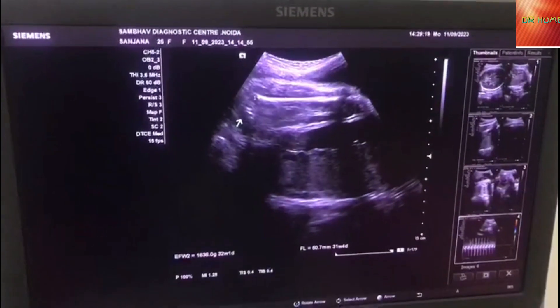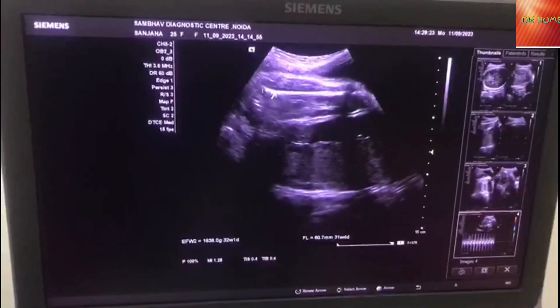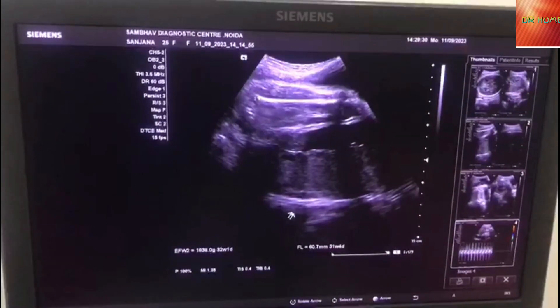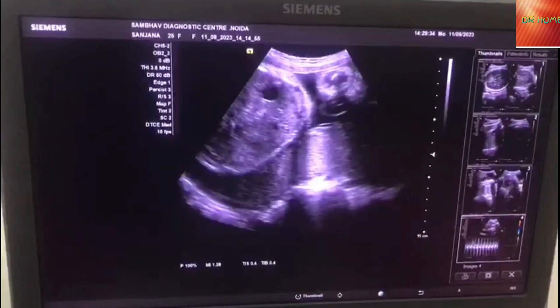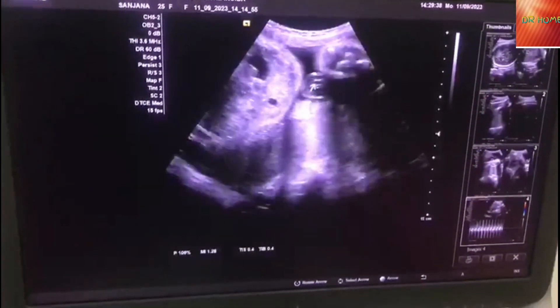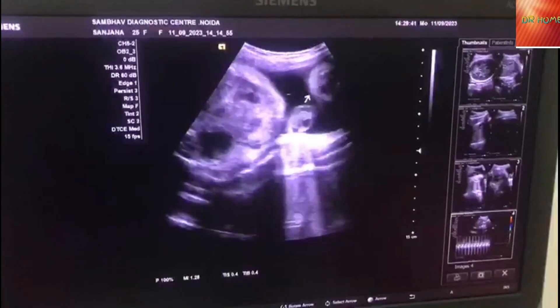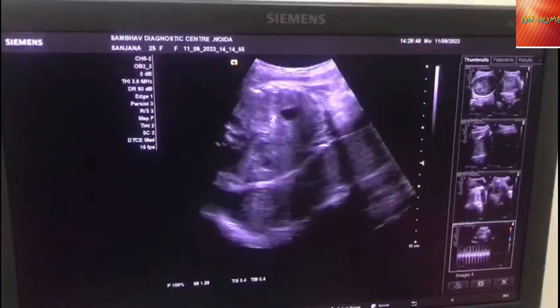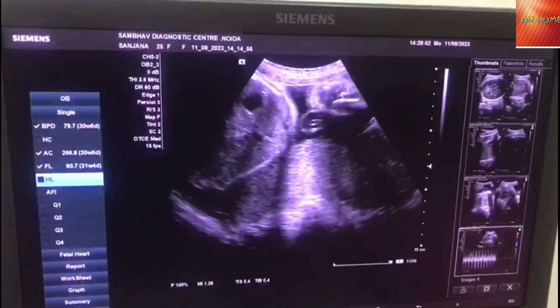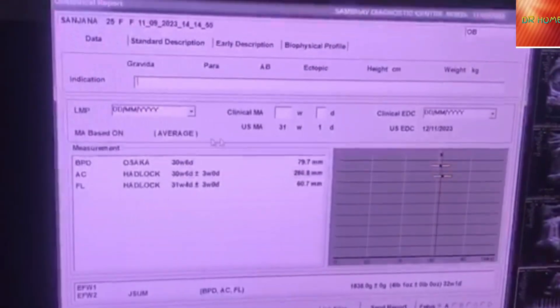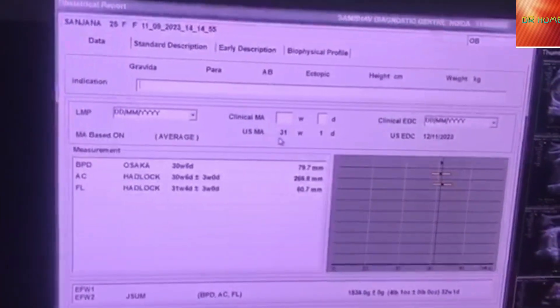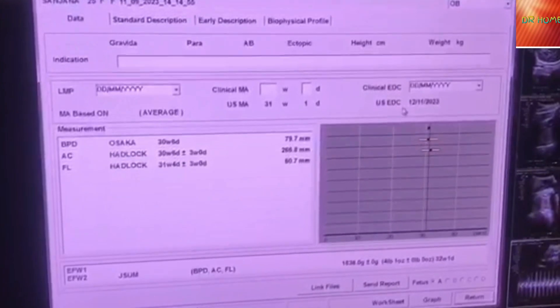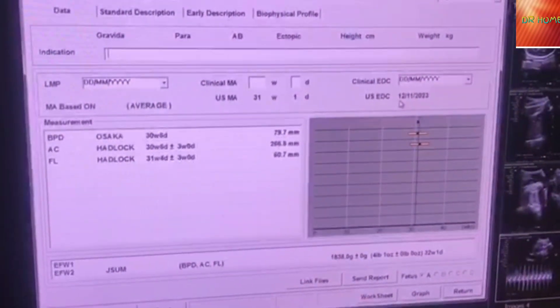Here we take measurements — at about 31 weeks, we take them in millimeters and the ultrasound machine automatically converts the measurements into weeks. The estimated gestational age coming is 31 weeks, meaning the baby has been growing for 7-8 months, and the baby's EDD — estimated date of delivery — is 12th November.